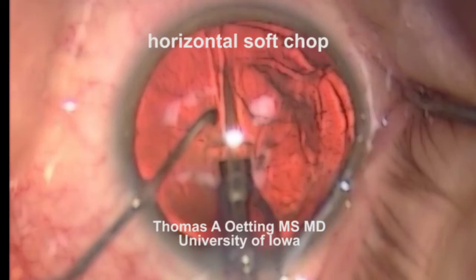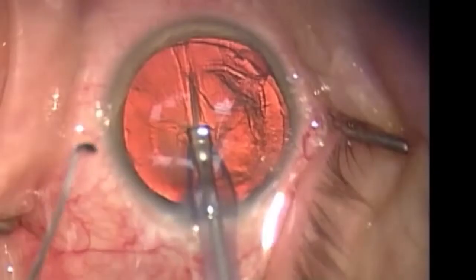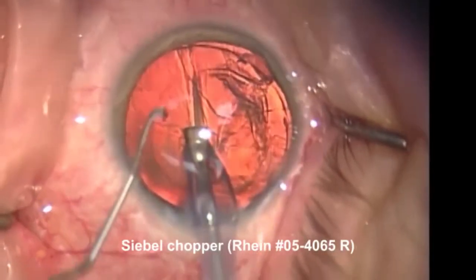Hi, this is Tom of the University of Iowa. I'm going to show you a useful technique when you've got a soft lens, and this is something we call the soft chop.